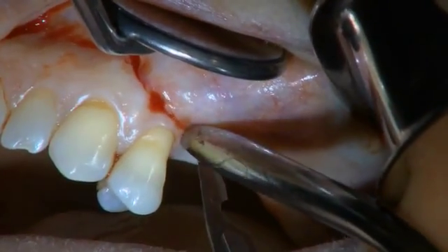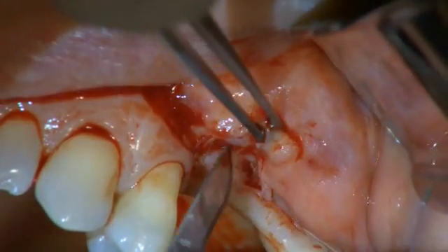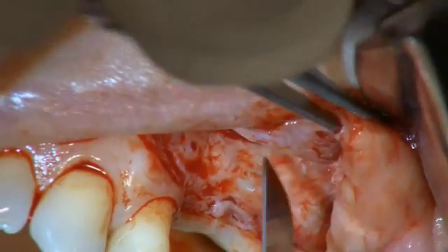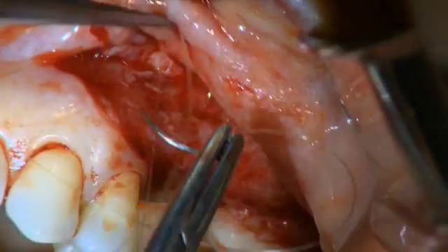We begin with a partial thickness flap, drawing a horizontal incision parallel to the mucogingival junction. The flap is prepared with 15C and 15 blades, and the mucosa is apically repositioned with respect to its original position.